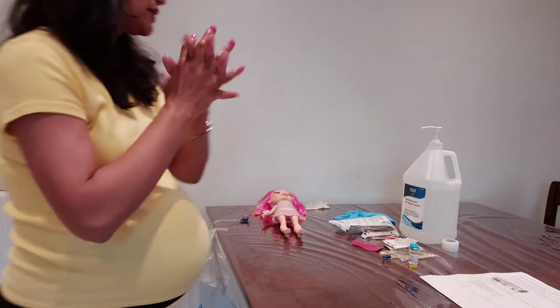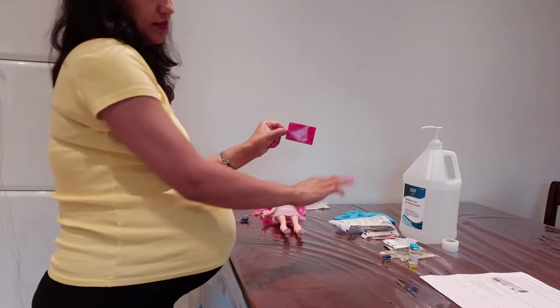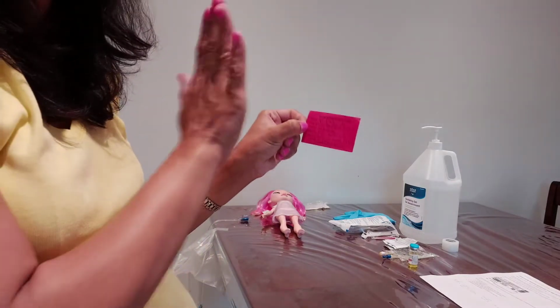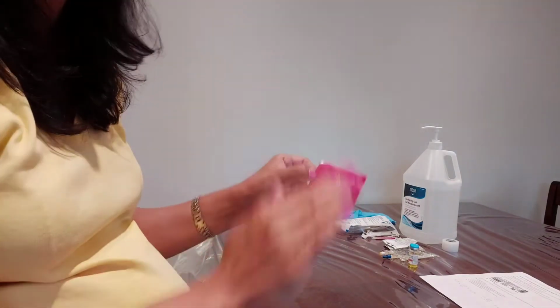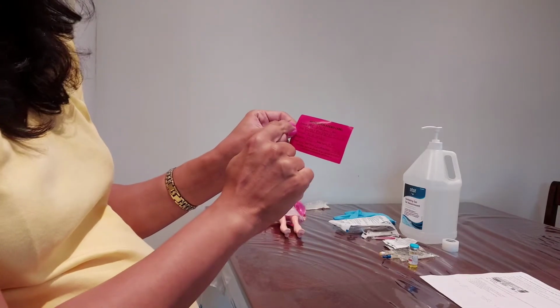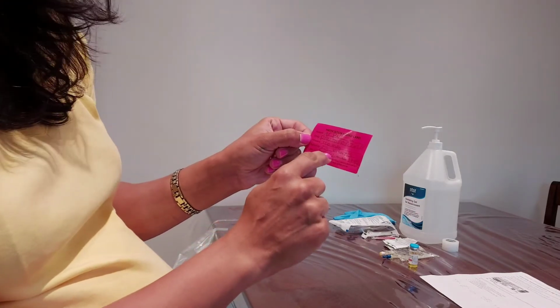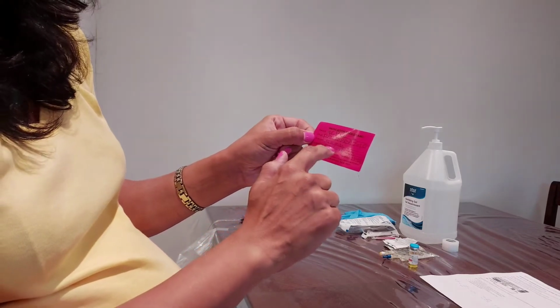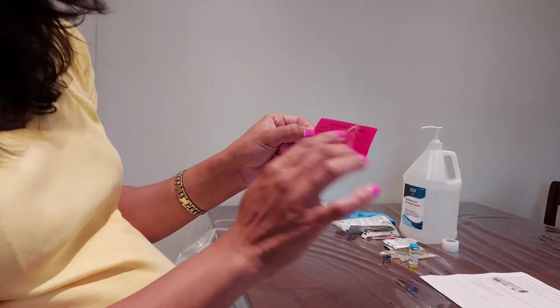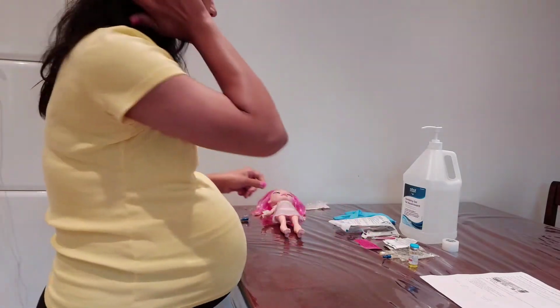I already prepared the label that I need to put on the mini bag, but I don't stick it on the mini bag until everything is prepared and okay. On the medication label, I have to put the patient's name, drug name, amount of the drug, added by the initials of the nurse, and the baseline date, that is today's date, start time, and flow rate. I already added all this to the label.